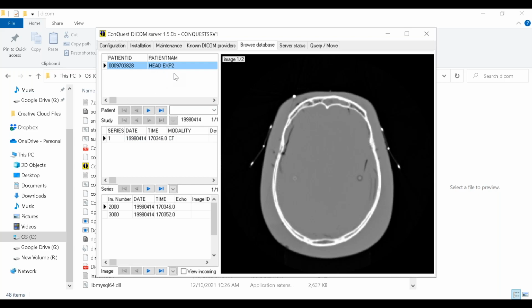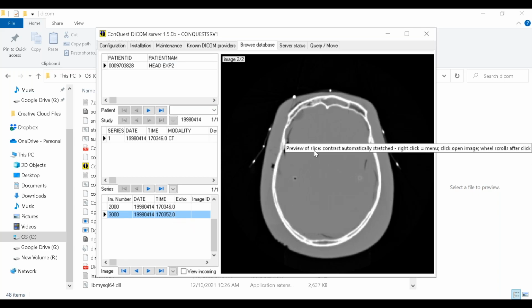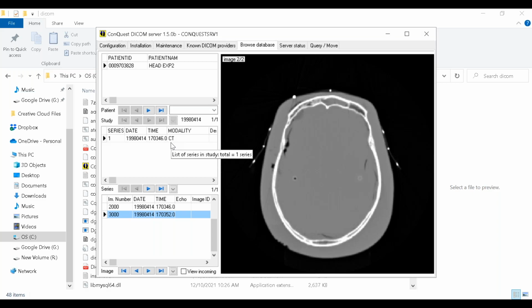Notice this is the patient name, head exposure number 2. There are 2 images. If I click on them, I do see those 2 images. They're pretty much a basic display of what you would expect for some form of a workstation. But you know, it's got something for us to use.